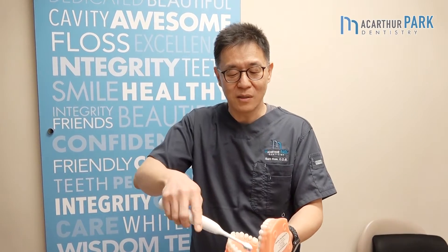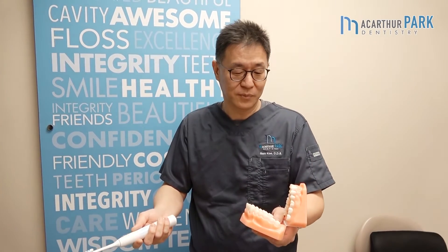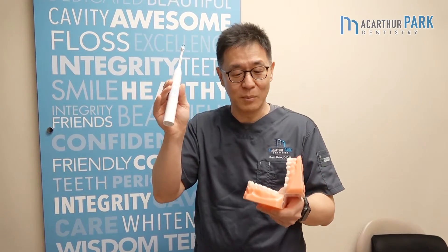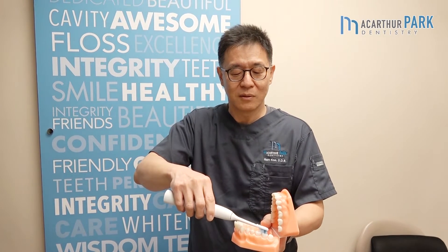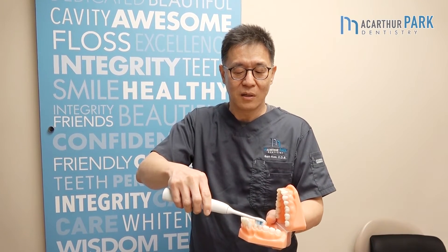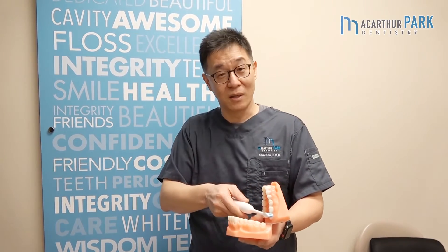Outside thirty seconds, inside thirty seconds, outside thirty seconds, inside thirty seconds — that counts for two minutes, because every thirty seconds it beeps. Then what you do is brush on the top of your teeth very slowly, and that brings you to three minutes.